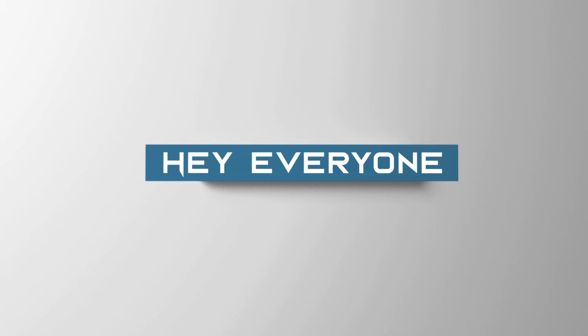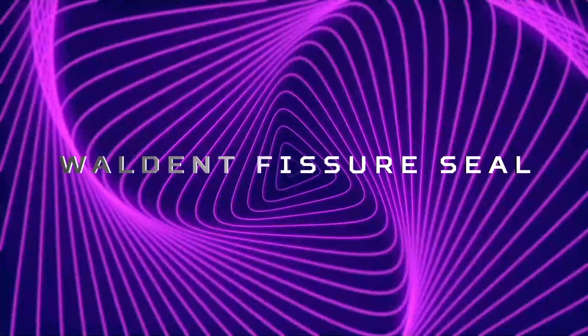Hey everyone, this is Dr. Sushmita. Today we will discuss Waldent Fissure Seal.